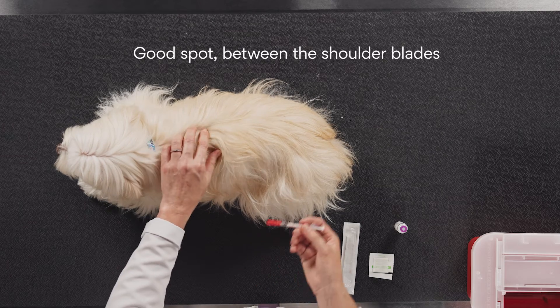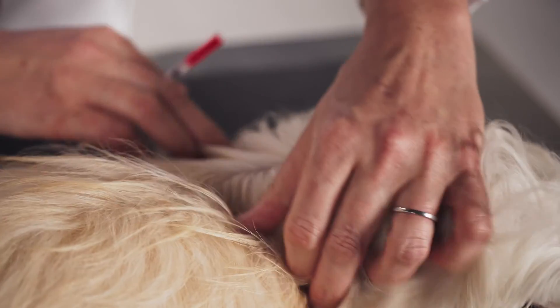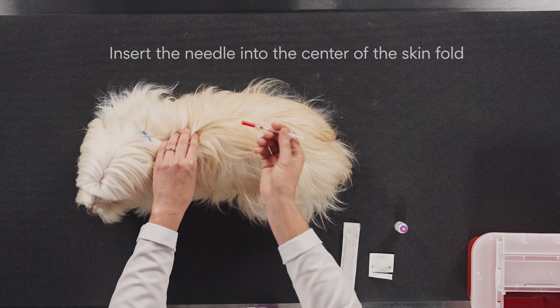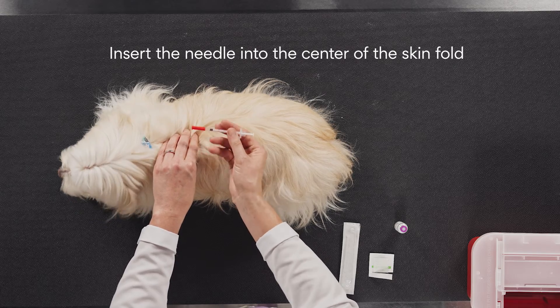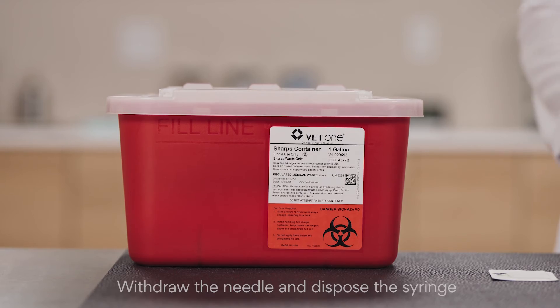Be careful not to touch the needle. You want to gently pinch an area of loose skin on your pet's back, like a little tent. A good spot is right here between the shoulder blades. If your pet has longer hair, like Charlie, you may need to part the hair to make sure that you hit your target. Insert the needle into the center of the skin fold, then gently push the plunger all the way down to dispense the insulin. Carefully withdraw the needle and dispose of the used syringe in your sharps container. And you're done.